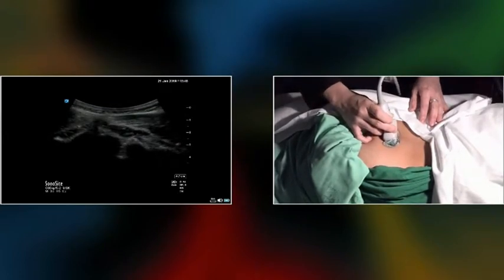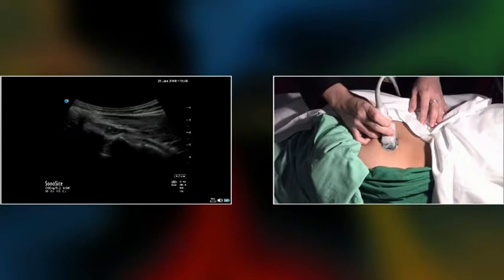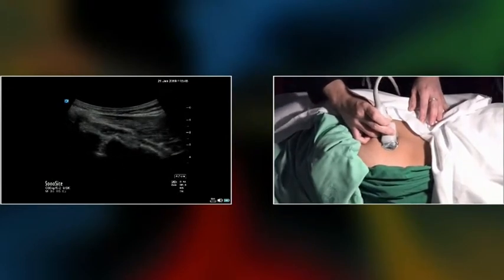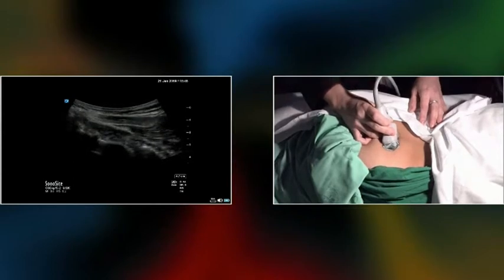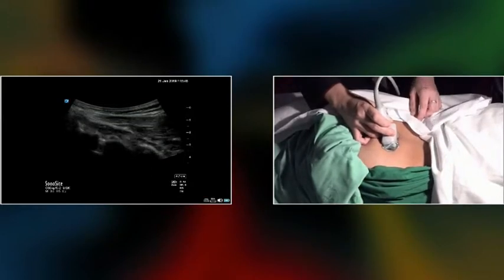Yep, I think I see something here. And this is the sacral foramen for sure. Probably S2. And then you can see the gap on the right side of that. Yep, that is the sacroiliac joint. You can tilt up and down a little bit. The gap is not going to be that wide, so don't imagine that it's going to be like a big hole. It's just going to be a small gap.